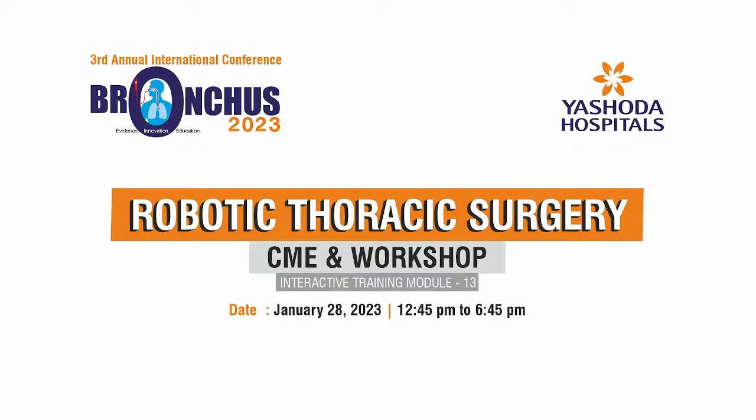So it took me almost 6-7 hours to figure out. Because here we charge the patient 1.4 lakhs to 2 lakhs extra for the robot, along with robotic staplers. It comes to around 2.5 lakhs. And if you tell them that you have done open surgery, it is seen as a big thing. They don't understand that it is done for safety reasons. So I had to do a camera port, another in the fifth intercostal space, and do it by VATS, something like that.